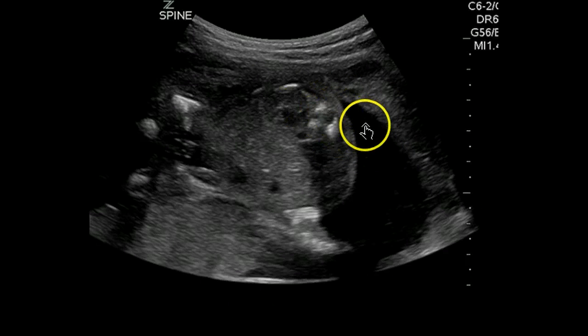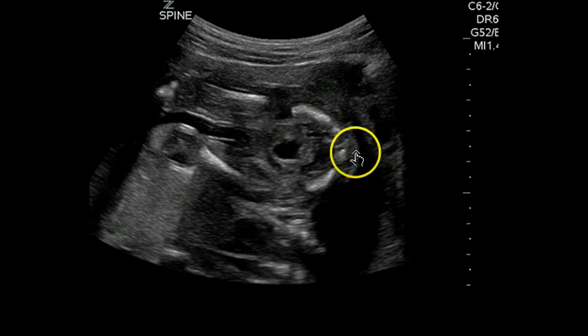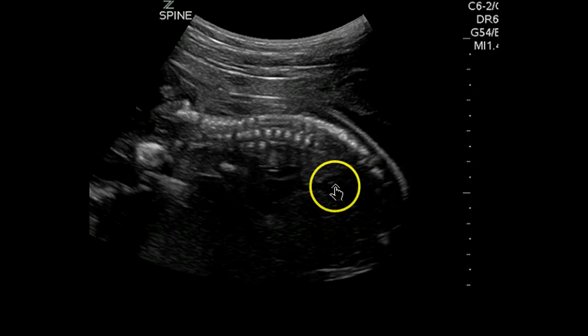The posterior elements are angling the correct way. Here you could start to think, am I getting tricked? What's this? Is there a big opening here? I don't think so. The skin is covering it. There's no cyst. I wouldn't be worried about it. Sacrum, iliac wings. Sacrum, we see bone down there. We're happy.